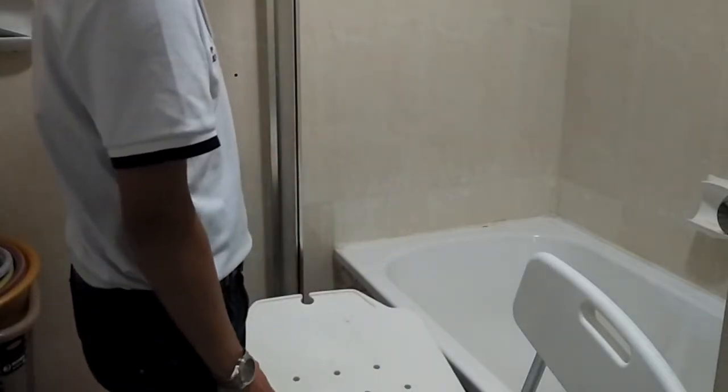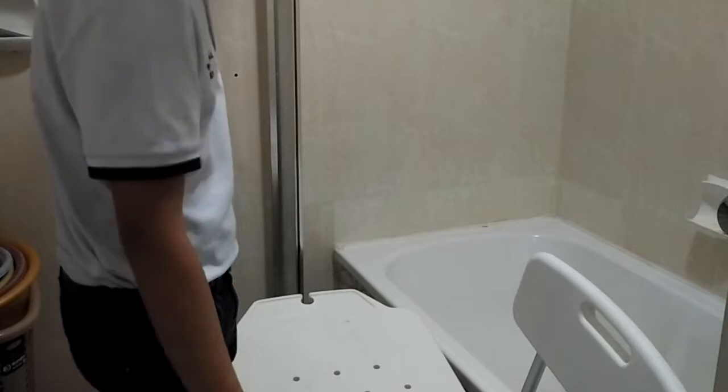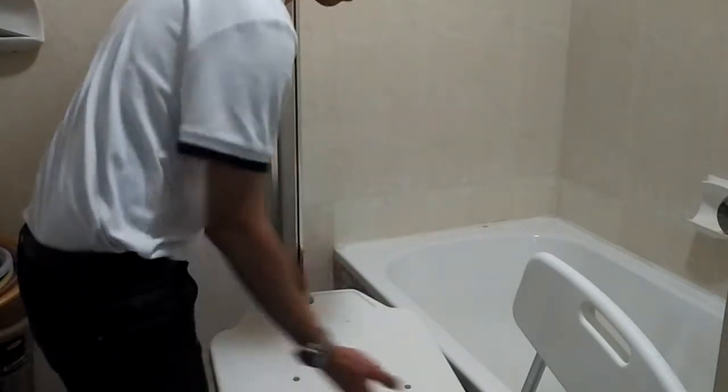Before installing the transfer bench, we need to check if the ground is level so that the legs of the chair have a stable surface to stand on.